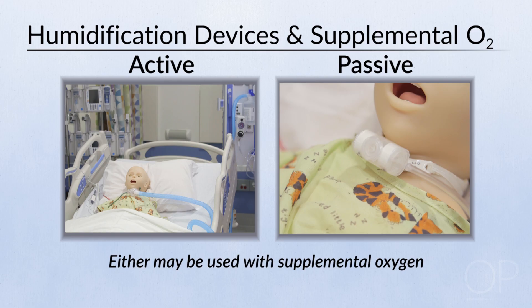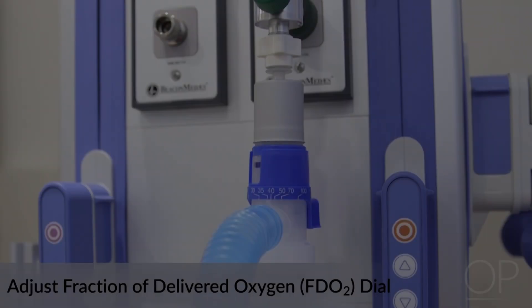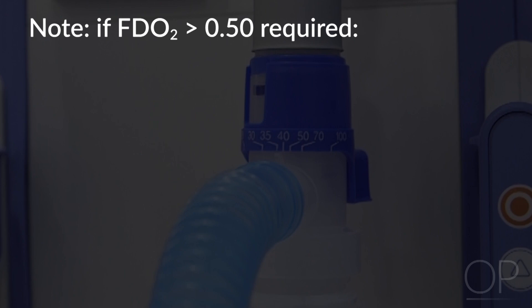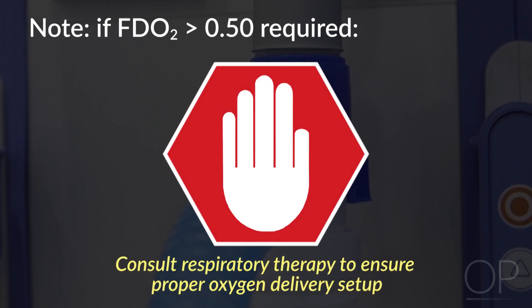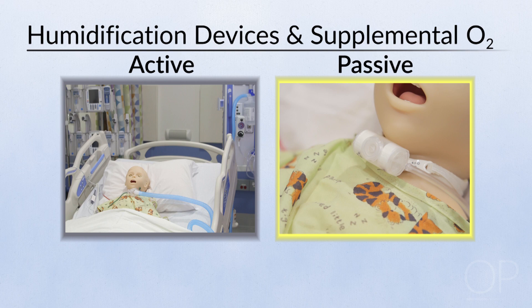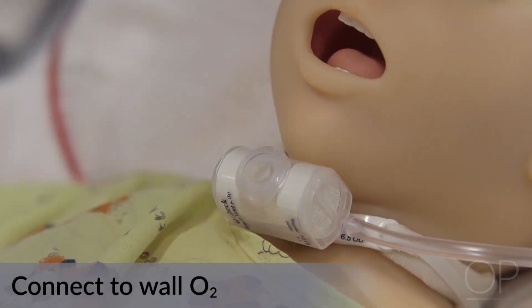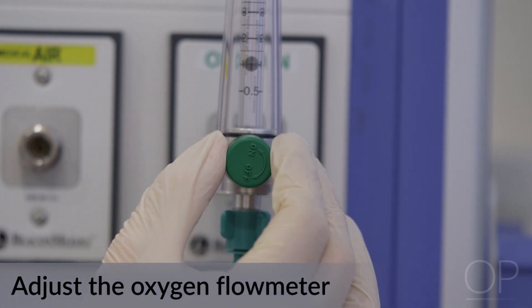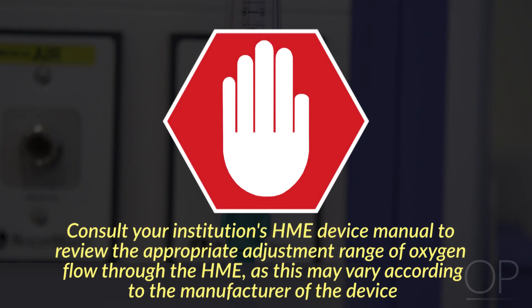If supplemental oxygen is required, you may utilize a large volume nebulizer or an HME. When utilizing a large volume nebulizer, ensure use of an oxygen flow meter and adjust the FiO2 dial accordingly to maintain acceptable oxygen saturations per prescriber order. Note that if an FiO2 of greater than 50% is required, consult respiratory therapy to ensure proper oxygen delivery setup. If supplemental oxygen is required with an HME, you must utilize an HME with an oxygen adapter. Connect the side port via oxygen tubing to a wall oxygen flow meter and adjust the flow per prescriber orders. Consult your institution's HME device manual to review the appropriate adjustment range of oxygen flow through an HME, as this may vary according to the manufacturer.